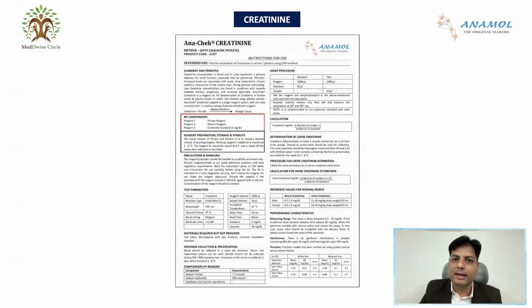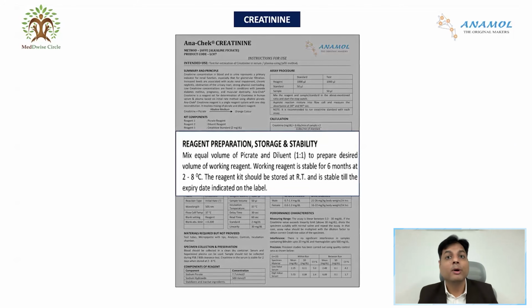Second thing that we need to understand is how to do reagent preparation. Now, friends, whenever we open the diagnostic kit, it is not necessary that the reagents which are given in the diagnostic kit are ready to use. That means we just open the bottle and straight away take the reagent in the test tube for reaction. It is not necessary. Sometimes the reagents which are given in the kit are not ready to use. They have to go through a process which is called reagent preparation.